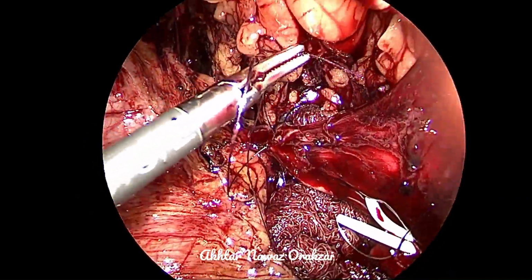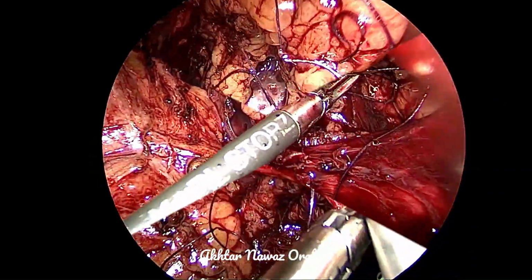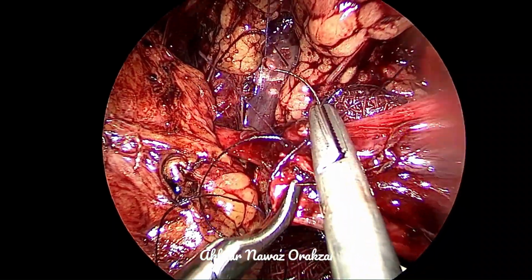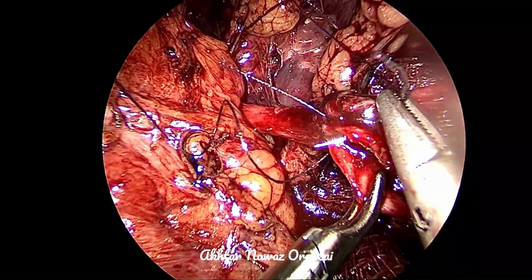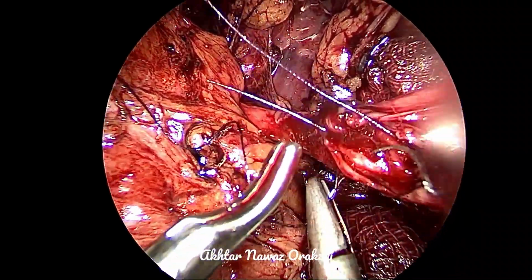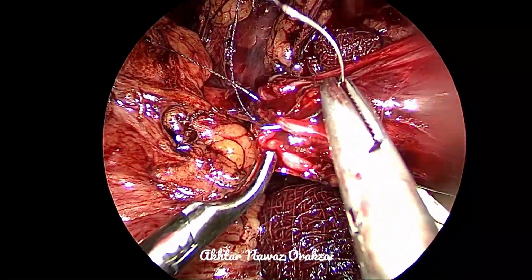Some surgeons prefer to take interrupted sutures initially near to the corner, 2 or 3 stitches, and then the rest of the anastomosis is continuous suture. You can perform with whatever you are comfortable with. I have no problems doing the continuous sutures, so I will do the continuous suturing.